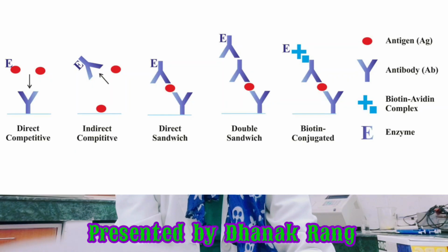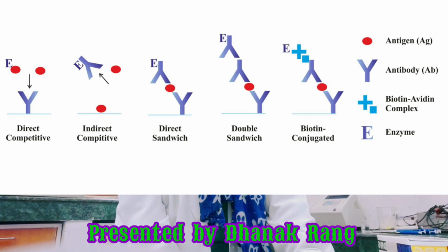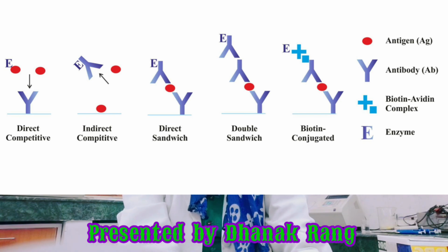Hello everybody, today I am going to demonstrate the estimation of serum insulin using ELISA. So first of all, I will demonstrate the standardization of the ELISA kit. So here we are using the DRG insulin ELISA kit.